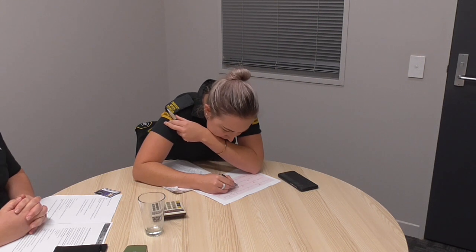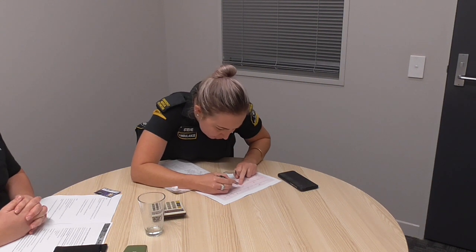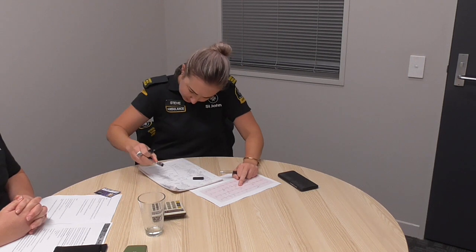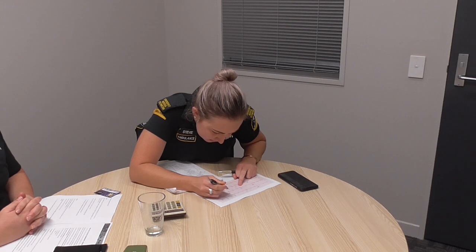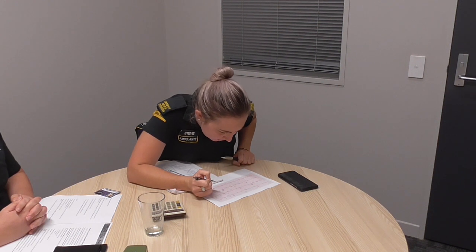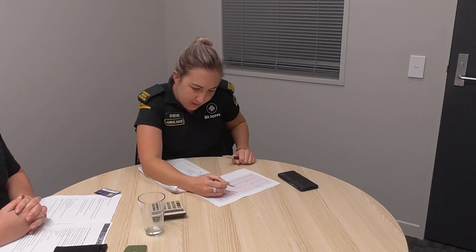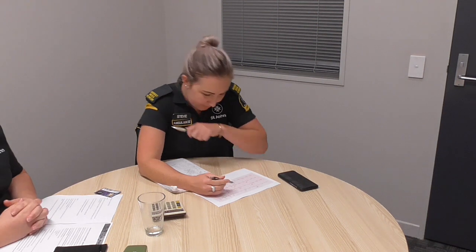Because it's a male, we need elevation of 2 small boxes, or 2 mils in V2 and V3, which we've got. Could I see a posterior, just to see for reciprocal changes? Don't have one available. Okay.